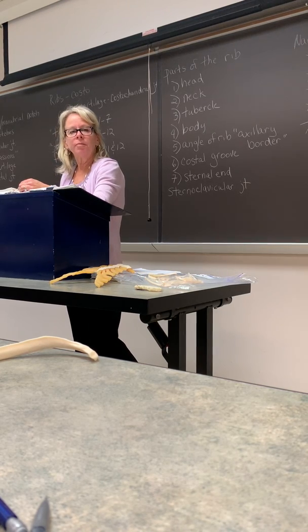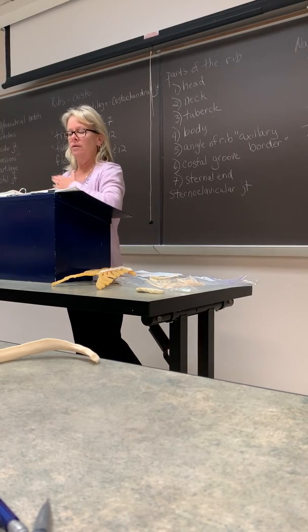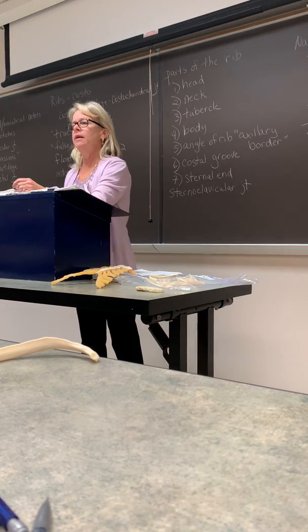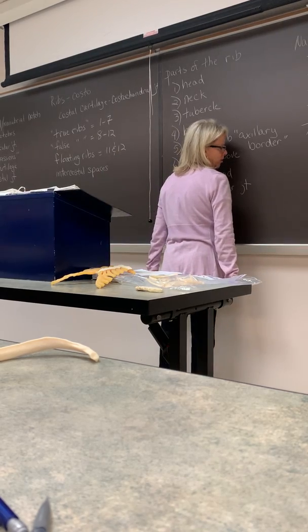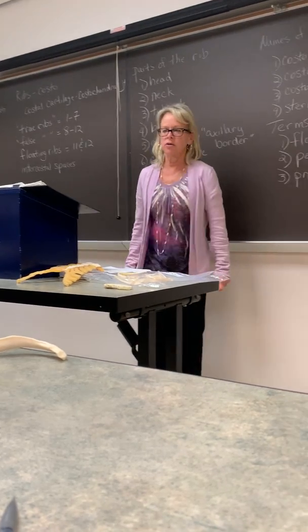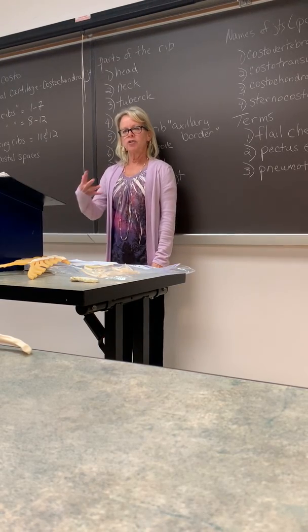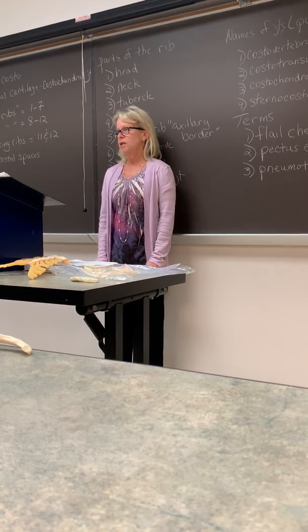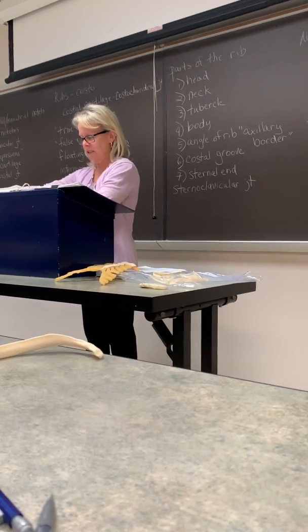So it's the opposite for posterior rib injuries. If it's a posteriorly injured rib, you want to do them AP for the same reason. Puts the posterior ribs closer to the image receptor.